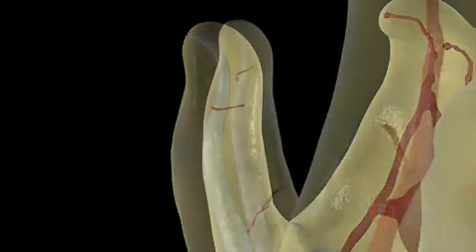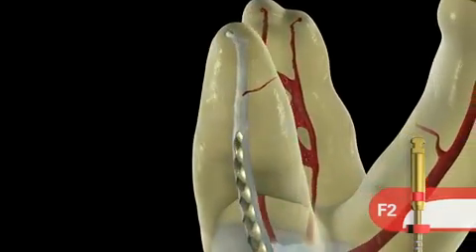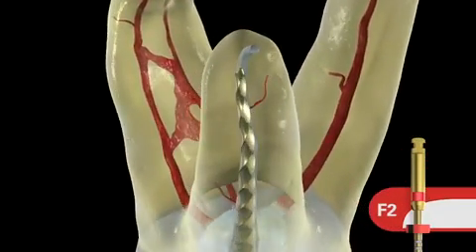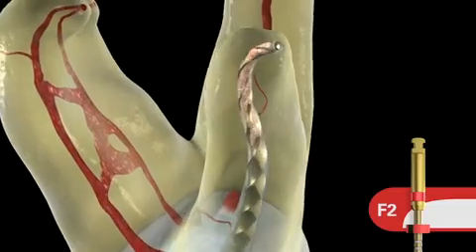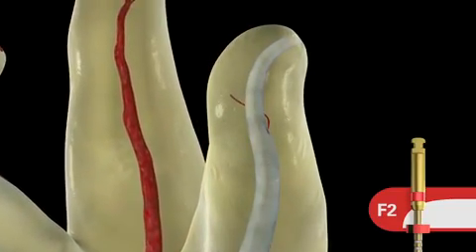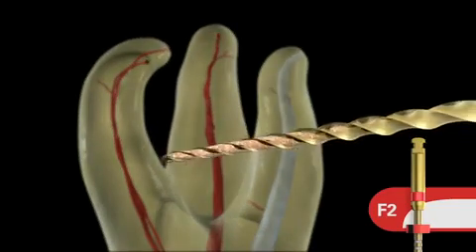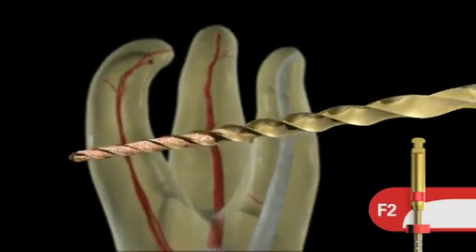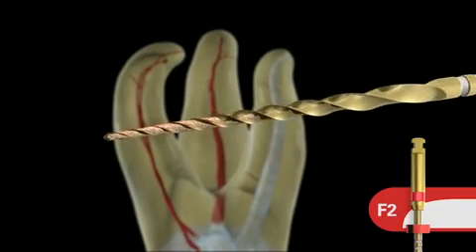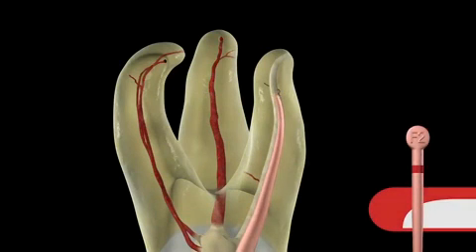That would be the red 2508. Appreciate the 2508 is just an 8% taper in its apical 3 millimeters. Dead soft metal rapidly negotiates the curve in a very safe way, and now you have a blended shape from the foramen to the orifice. Again, look at that apical part of that instrument. Appreciate if it's totally loaded. If the blades are loaded, the shape is done.